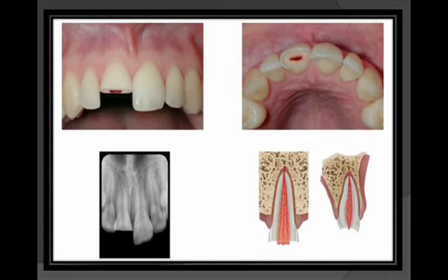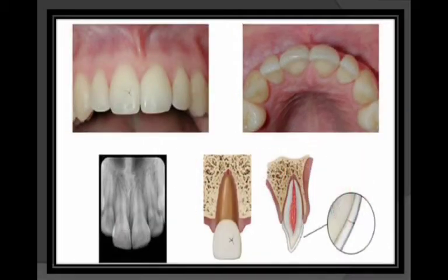Another periapical radiograph is used to distinguish between complicated crown fracture and uncomplicated crown fracture. See in this image clinically we see the pulp exposure, and in the radiograph the fracture continues to the pulp, and that is called complicated crown fracture. But in this image the fracture is simple, and in the radiograph the pulp is not affected by the fracture, so that's called uncomplicated crown fracture.